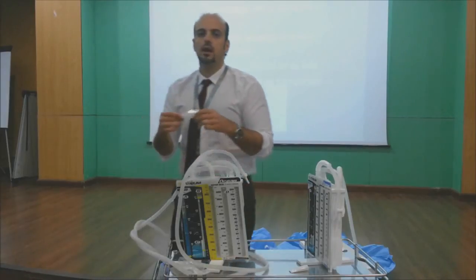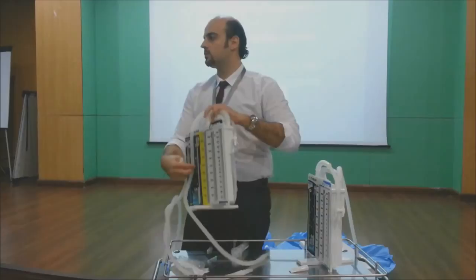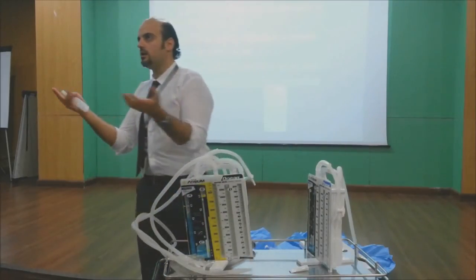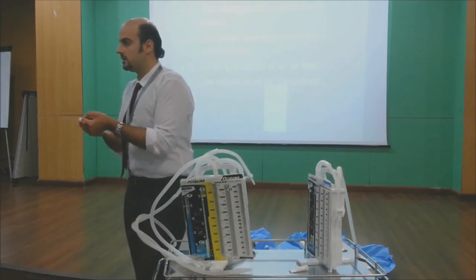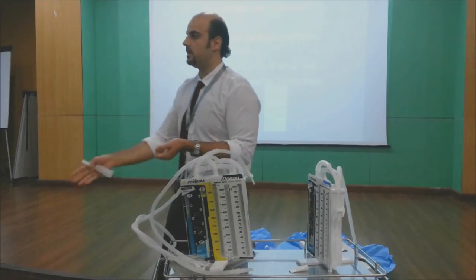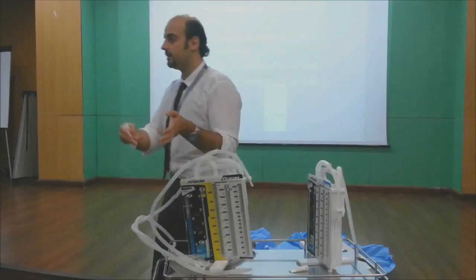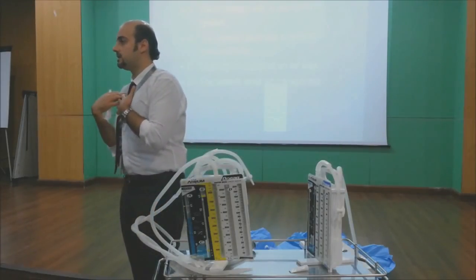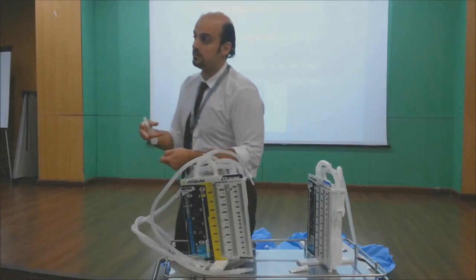How to judge? If I see a lot of air leak coming from underwater, mentally I'm thinking, if I clamp this, all this air will collect again into the chest. There is a lot of air leak with all inspiration and expiration. So if I clamp this, what will happen? This air will leak from here and collect inside the chest. So just pay attention if I want to clamp this patient.